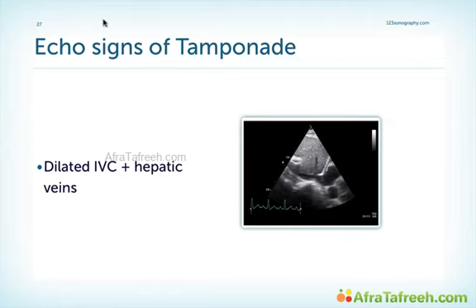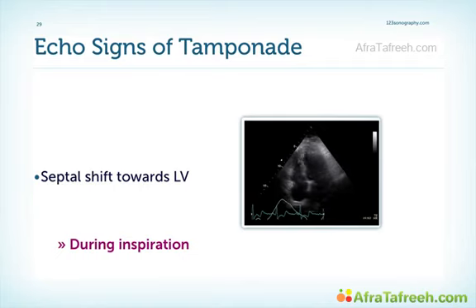In this setting, you will very frequently have some form of hemodynamic significance. Of all the different echo signs in tamponade, I still believe that the abnormal interventricular motion, which reflects the interventricular dependence, is the strongest sign for tamponade. To demonstrate the dependency of this motion with respiration, you can use any view where you can see the interventricular septum. Here is the 4-chamber view.